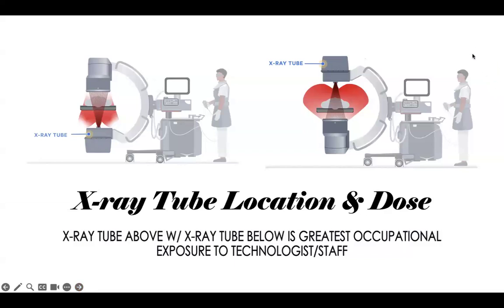So, X-ray tube location. We know in our fixed fluoro room, we learned that the tube is at the bottom and the image intensifier is at the top. Same concept with the fluoro tube. Our tube is at the bottom, image intensifier is at the top. So it should mainly stay that way.